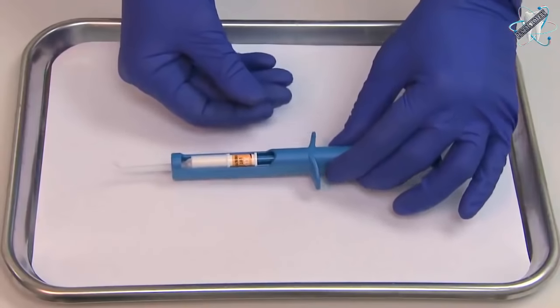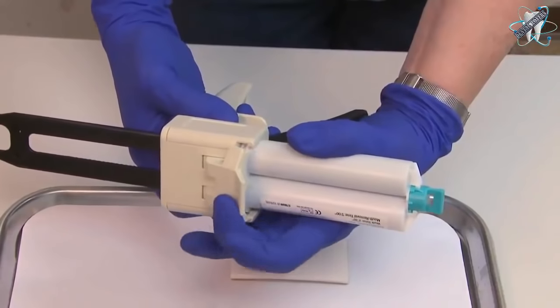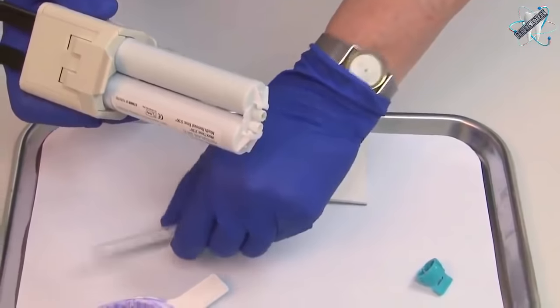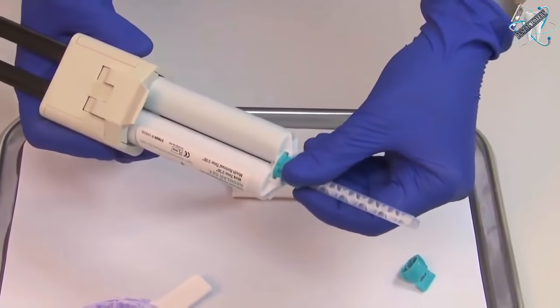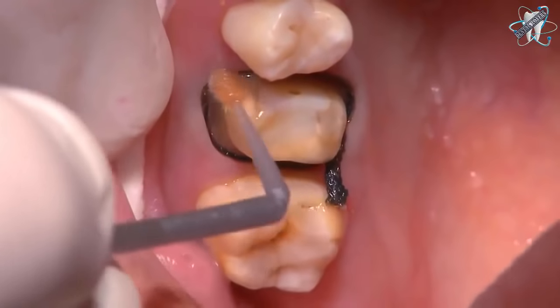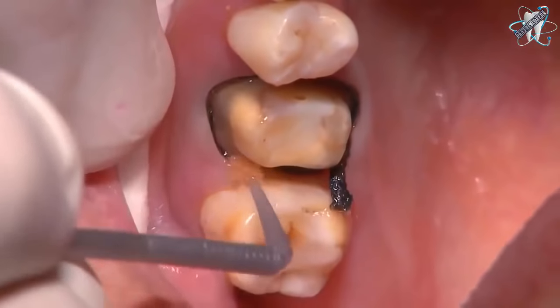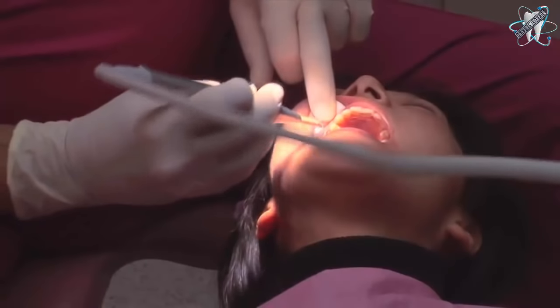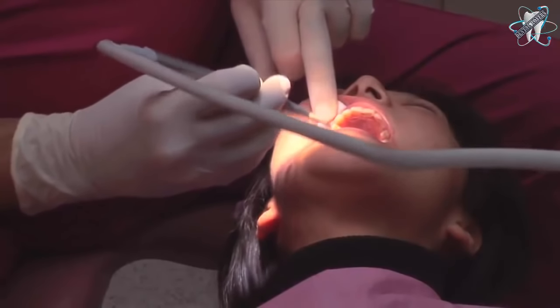No more back-filling syringes. We will be using AquaSil Ultra Rigid Fast Set as the tray material. The cartridge should be bled without a mix tip. Apply B4 Surface Optimizer to the preparation and the retraction cords until saturated. Excess amounts of B4 can be removed with a gentle stream of air or a microbrush. Notice the glossy appearance.